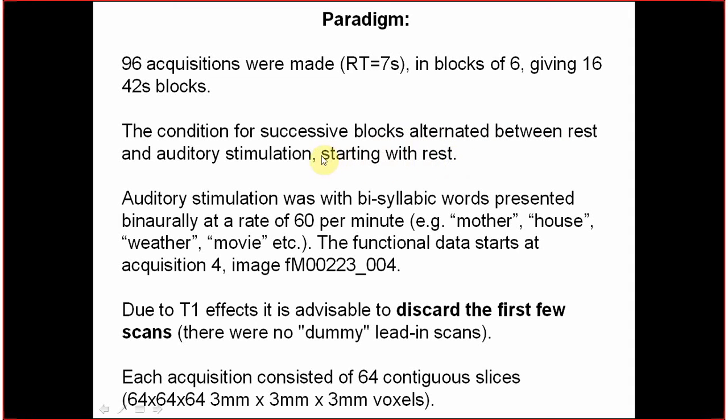Silence. If you can call silence what happens in the scanner. Actually, the MRI scanner itself is very noisy. So the rest is just the scanner noise, and this auditory stimulation is the scanner noise plus something else, which is listening to bisyllabic words presented every second, like mother, house, weather, movie, and so on and so forth.